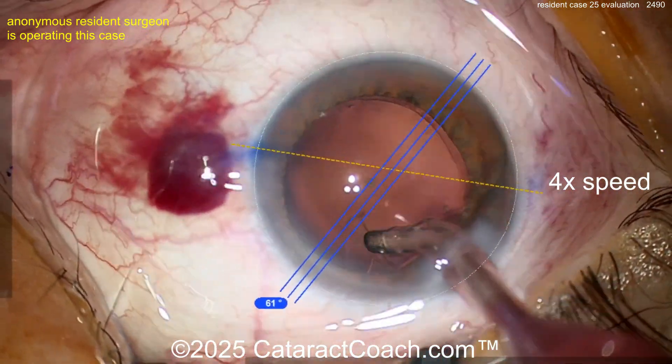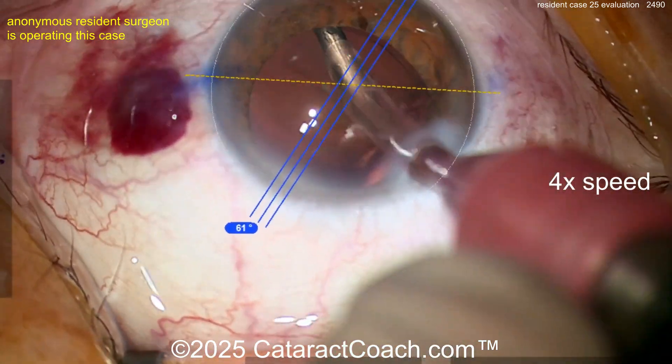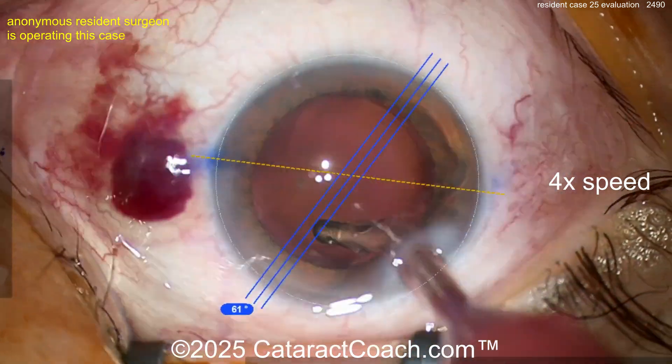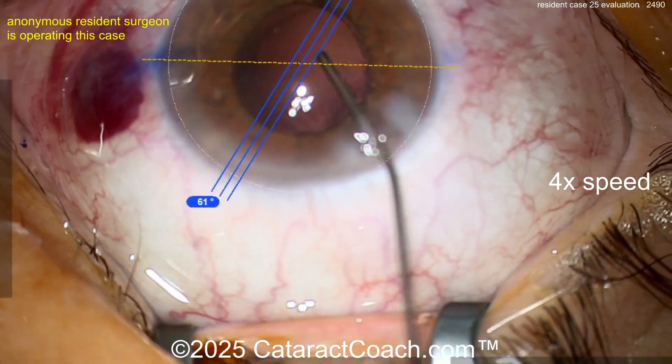Good cleanup. Listen — this is case 25, and you are doing fantastic. You have great hands. My advice is just focus on the little things: you don't need that big subconjunctival hemorrhage, the draping could be a little better, and the incision's a little short. You don't need the overlay on the entire case.